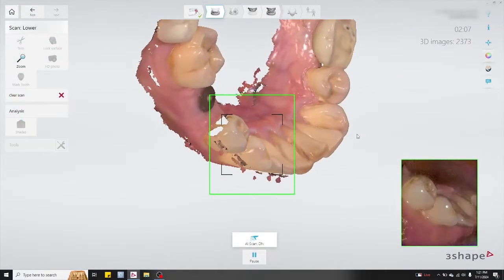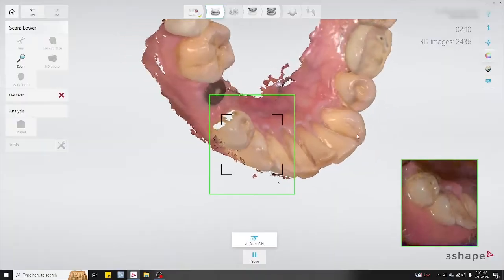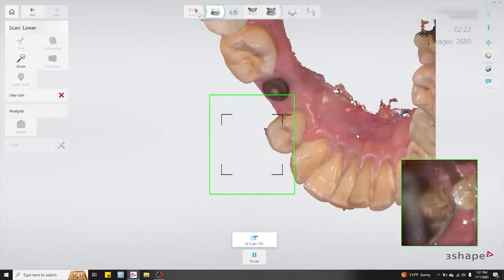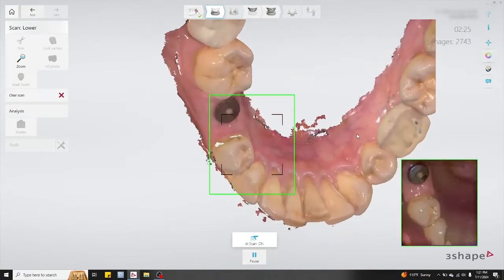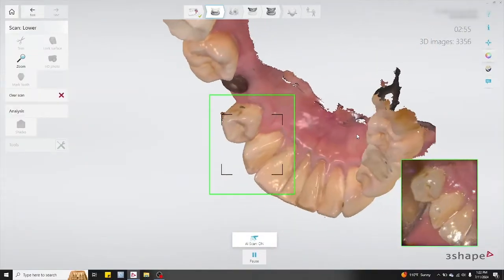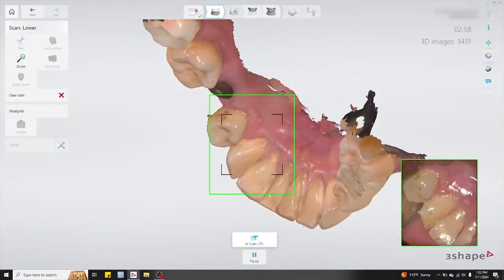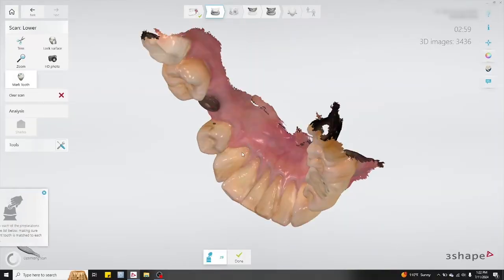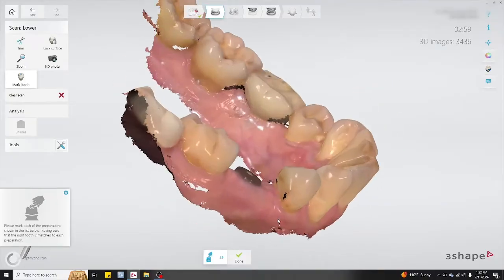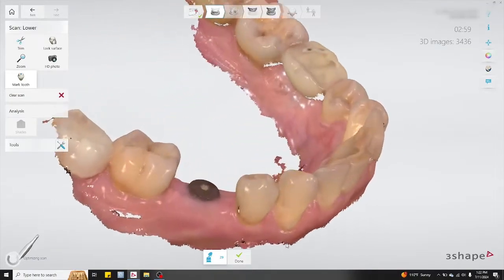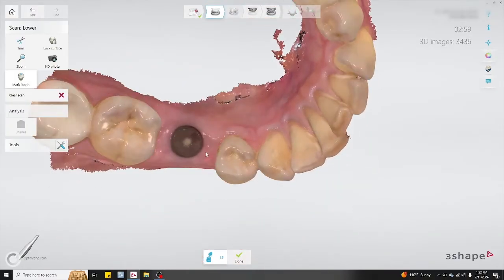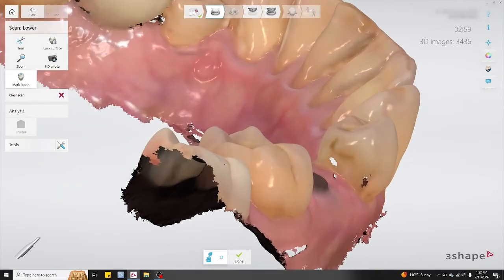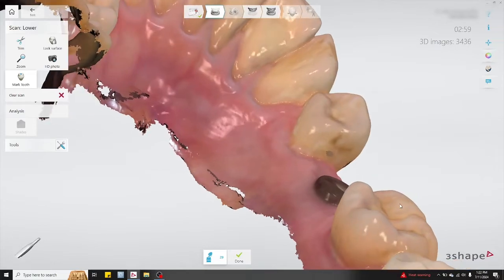Go ahead and scan the arch — you should see the healing abutment that's in the implant site. What's critical about this first scan is to accurately capture the interproximal surfaces. It's okay if you're missing some information as long as it's below the contact point of the crown, because sometimes that space is pretty narrow and it's hard to capture with the scanner not fitting in that area. This is particularly common as you get closer to the free gingival margin, so do your best to capture it in its entirety, but use your clinical judgment to determine if you've captured enough to move on.